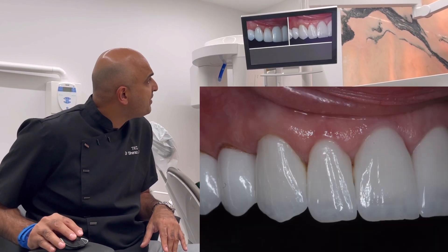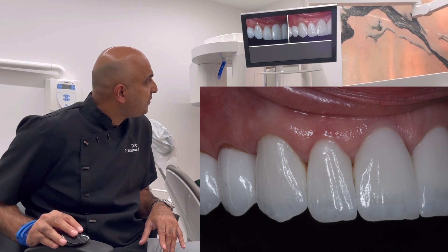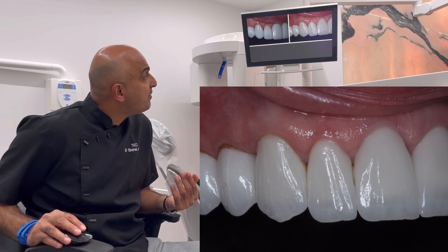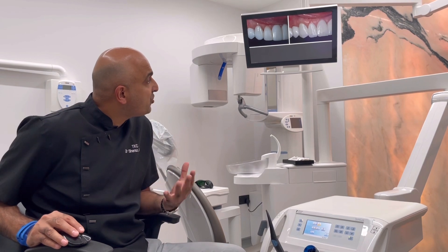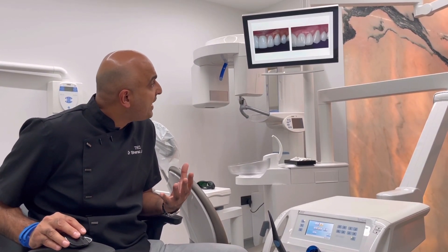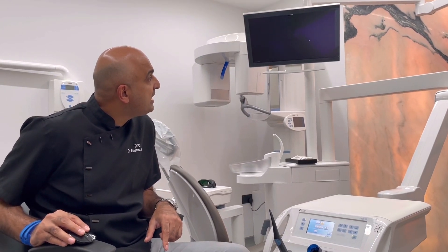These are the side-view shots — I'd love to change those remaining old ceramics at some point. But the key takeaway is that even though the teeth are very long, we managed to keep them looking really good and natural by adding lots of texture, lots of translucency, and a lot of detail. It's a really nice case overall.